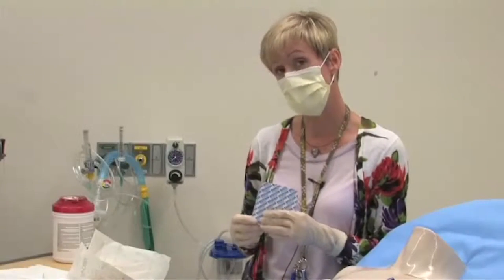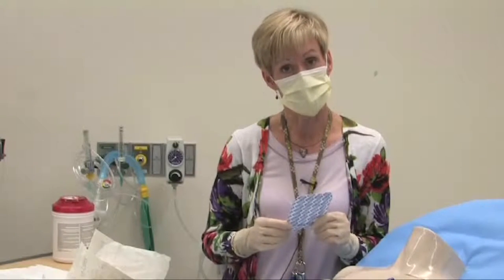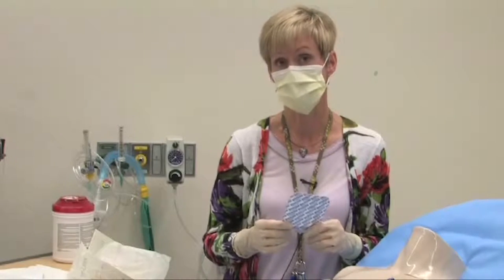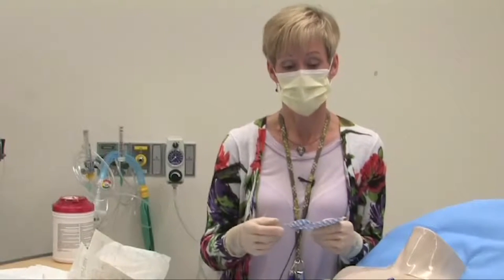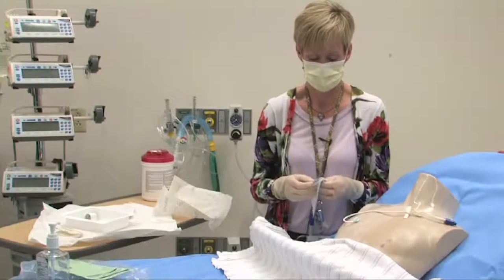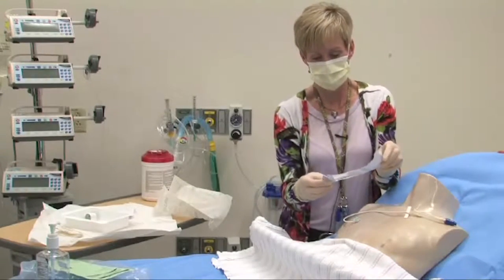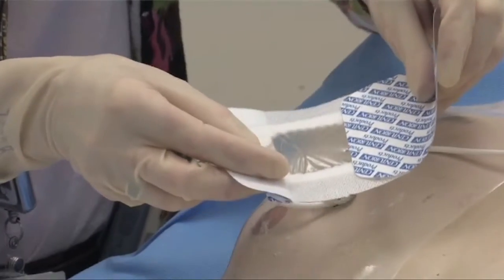We do not cover our line with a gauze unless there is excessive bleeding or drainage. We use the Center for Disease Control guidelines regarding covering the line. They propose a visual, clear window over the line so you can see the exit site. We place our dressing so that we can visualize the center and the exit comes out the bottom.